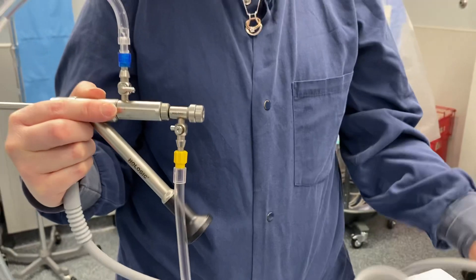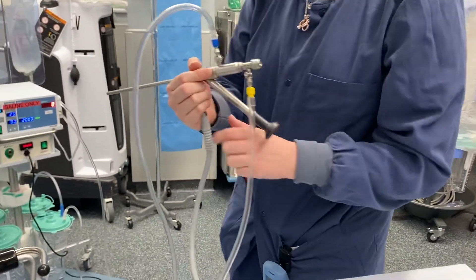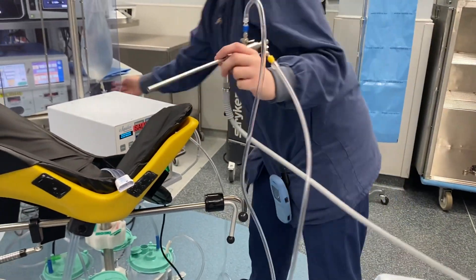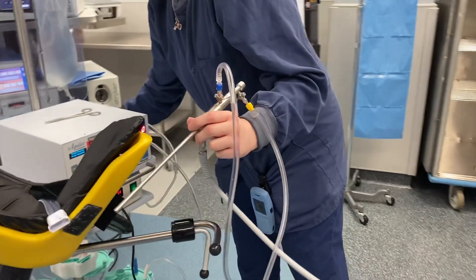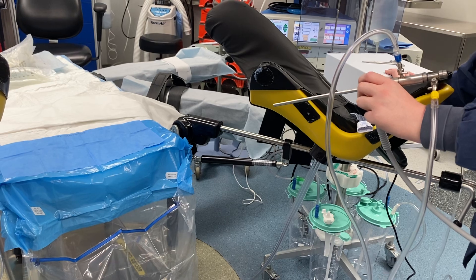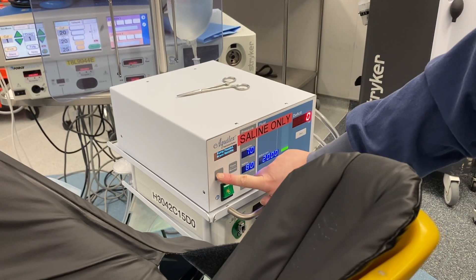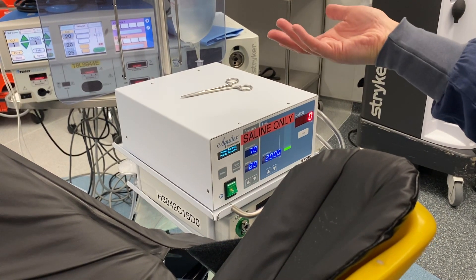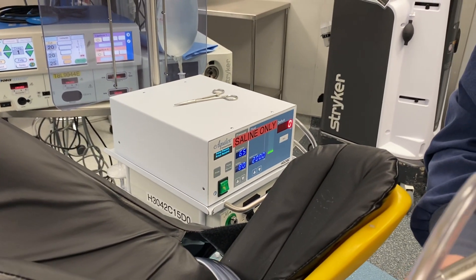At this point, the surgical tech can either prime in a bucket or hand it to the surgeon for the surgeon to prime in the drape. We're going to pull our Aqua Lex close. For demonstration purposes, we have to be creative. Your circulator will press the prime button — there will be two beeps. It'll beep once, and then you will wait about two minutes; it primes about 100 cc's. It'll beep again, and then you can turn off your inflow and be ready to go.